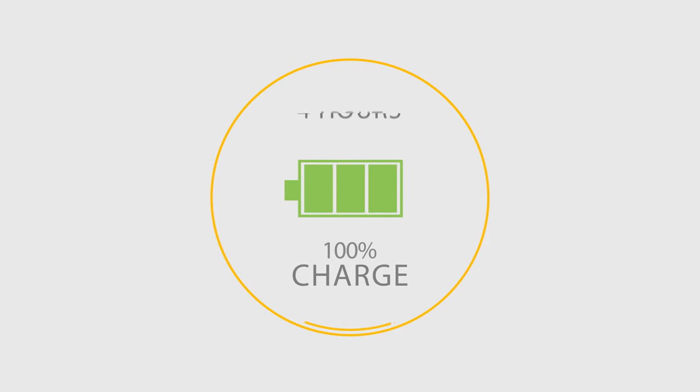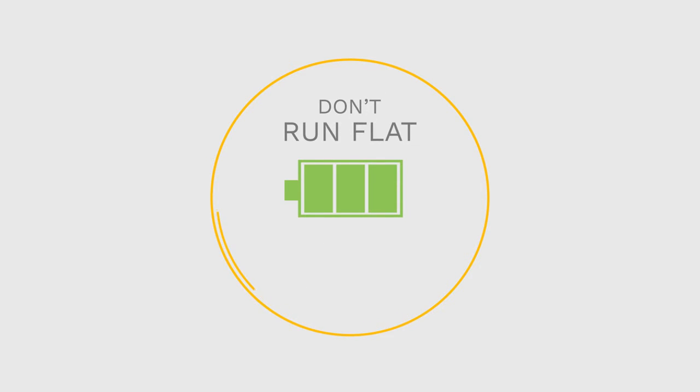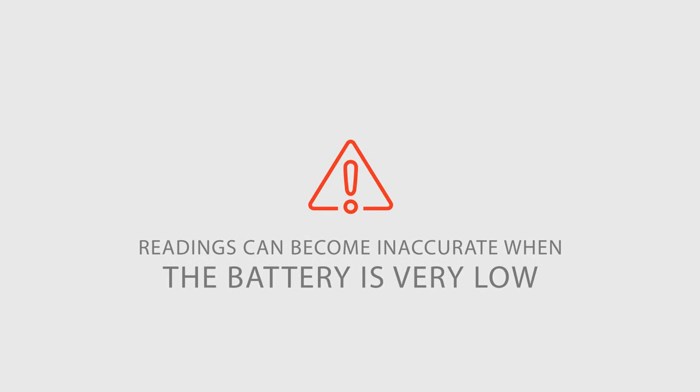After that, it's better for the health of your battery not to let it go completely flat and not to overcharge it. This is a bit like your mobile phone. When it's fully charged, this battery should run for 12 to 16 hours. Note that readings can become inaccurate when the battery is very low.